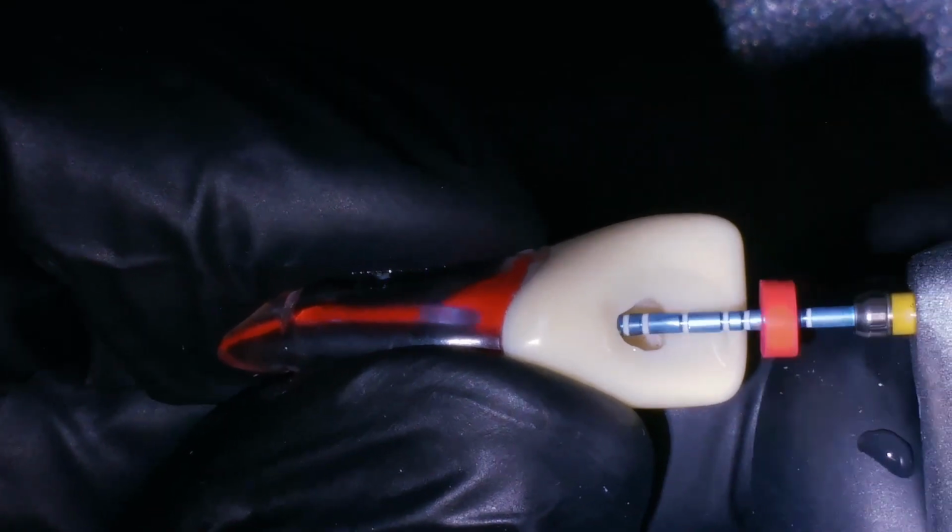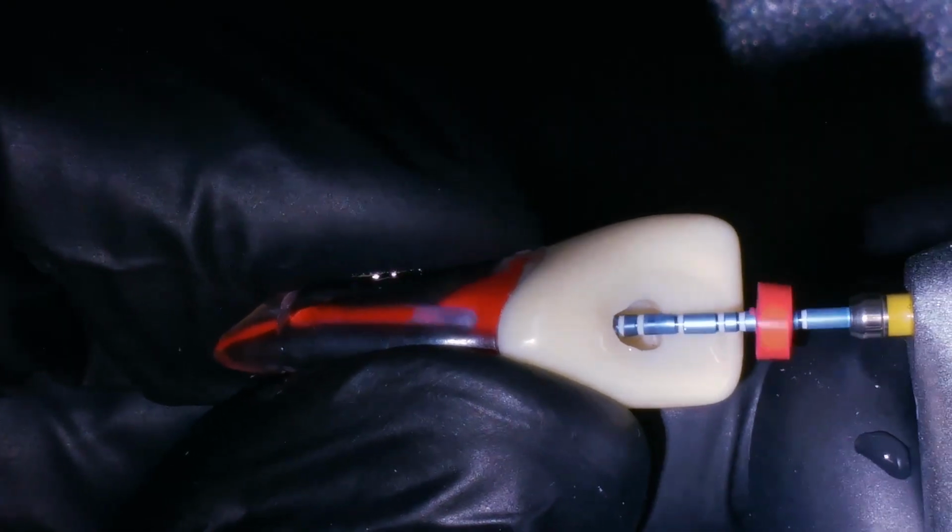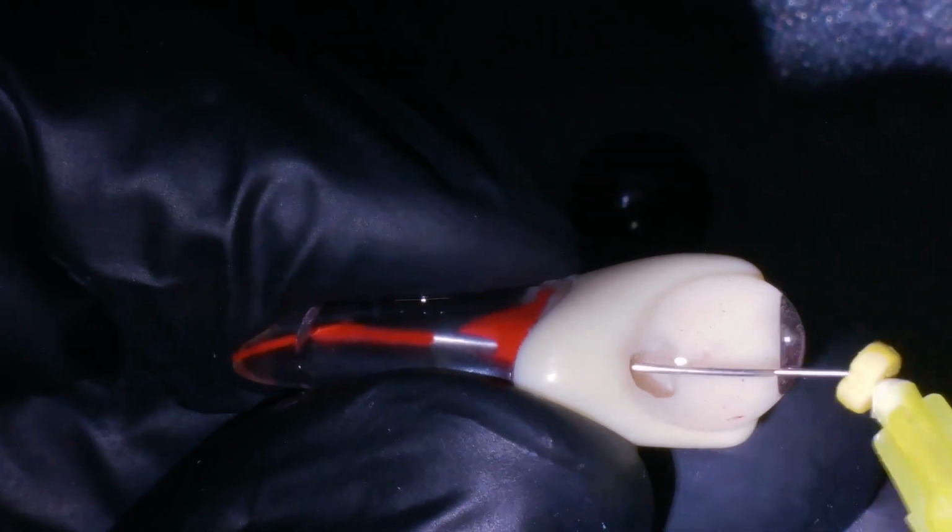Repeatedly use in and out motion of 1 millimeter increment while applying slight apical force. This is called picking motion. The apical force used should match that of drawing with a pencil. The file should be advanced till excessive resistance is encountered or working length is reached, whichever comes first. Don't force the file to reach the working length if resistance is felt. Instead, irrigate the canal and try again.